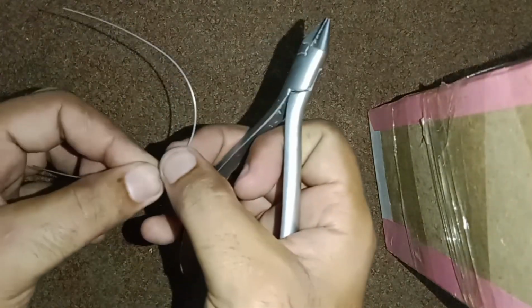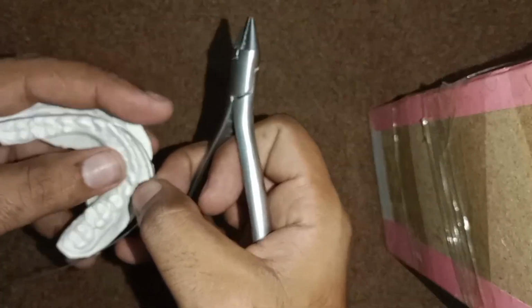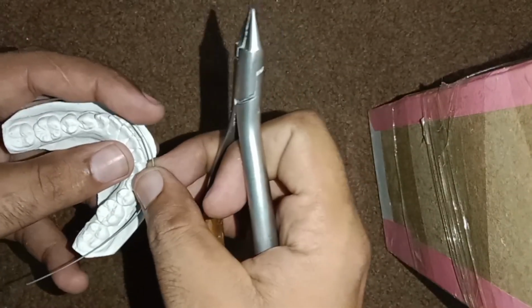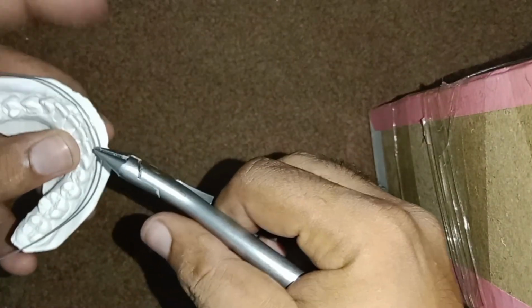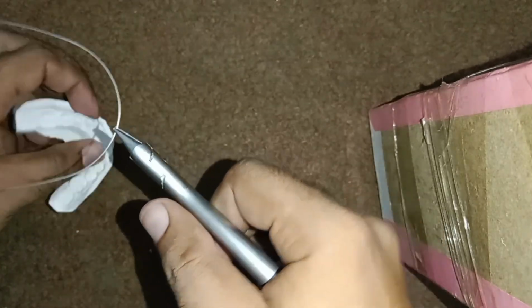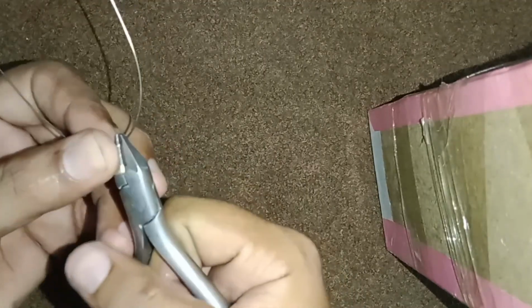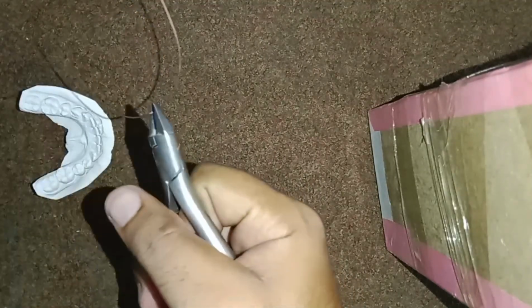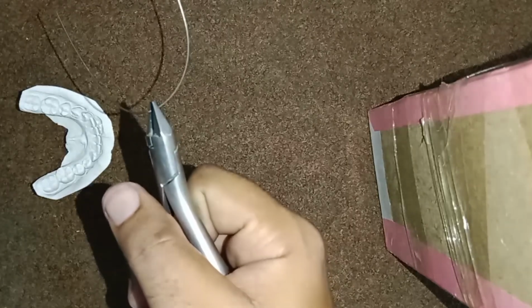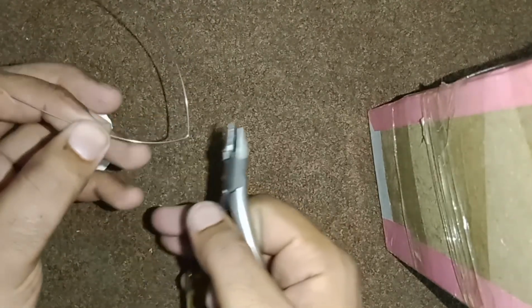Now for making the 3-piece intrusion arch, we will take a 1622 SS wire. We will mark a point on the wire distal to the lateral incisor, giving it a downward 90-degree bend.